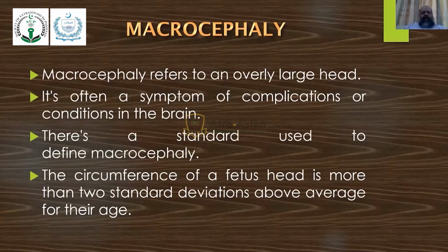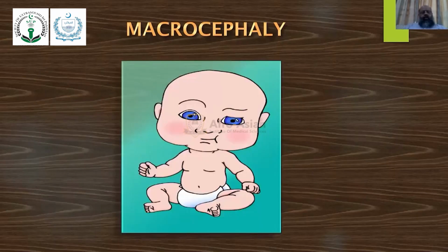intracranial bleed, any of the pathologies like ventriculomegaly. So we have to rule it out. So macrocephaly will be a larger head.